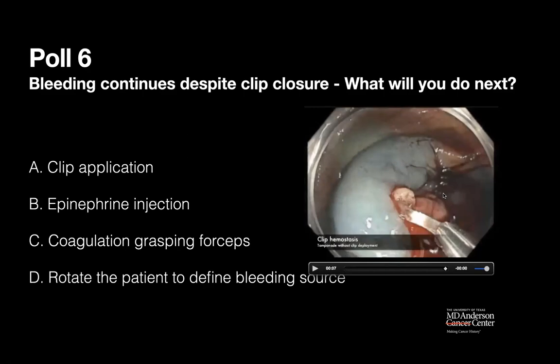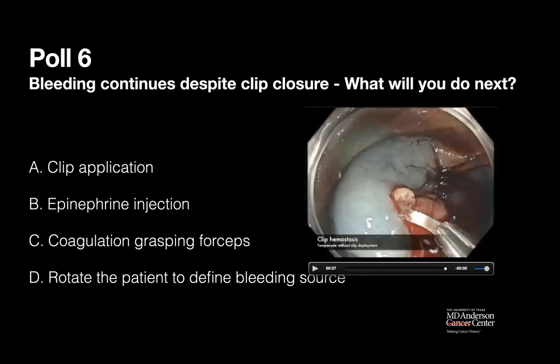All right. Sriram, what will you do? I agree with rotating the patient, but more importantly, if the anesthetist permits, if his vital signs allow, before I rotate the patient, I would try either tilting the head end of the bed up or the bottom end up to see if it would shift the blood away to allow a little better visualization. If not, then I rotate the patient. Okay.